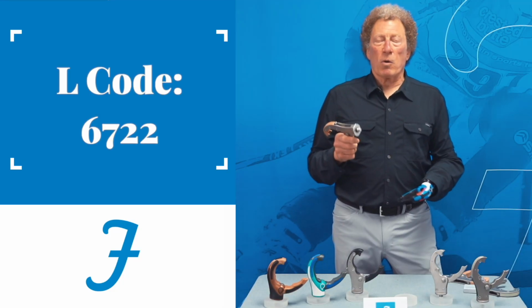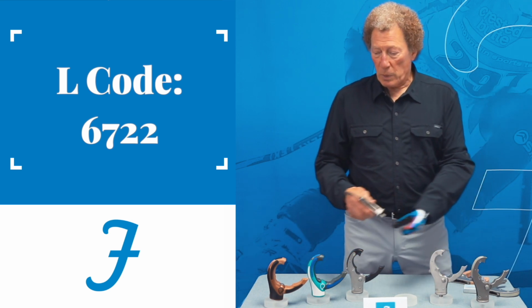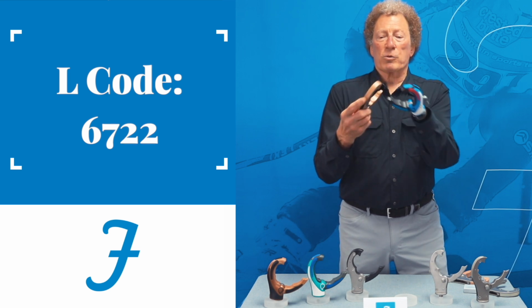All of these devices fall under the L code 6722. It doesn't matter whether it's the metal devices or those that have some of these other cosmetic or functional attributes.